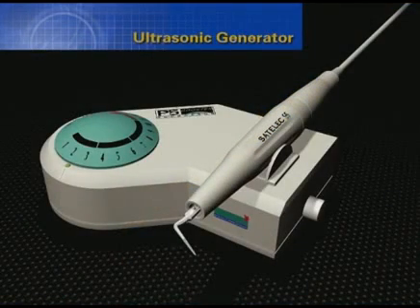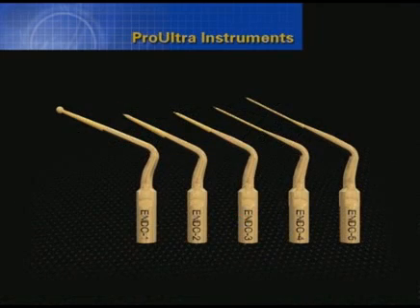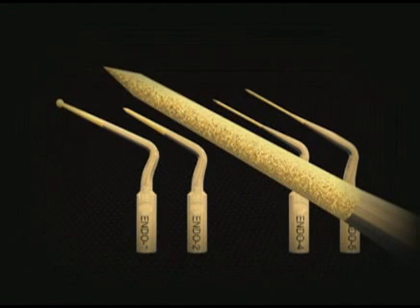The P5 piezoelectric ultrasonic unit provides unmatched power when performing endodontic treatment and retreatment procedures. This unit affords precise working accuracy and a broad power range, and its unique feedback system enhances safety by automatically regulating tip movement. The ProUltra Endo 1 through 5 tips are made of stainless steel and then externally coated with a zirconium nitride abrasive. These ultrasonic instruments can be introduced into small spaces while enhancing vision, improving performance, and expanding clinical possibility. The zirconium nitride coating enhances durability and enables the instruments to sand away materials during endodontic treatment and disassembly procedures.